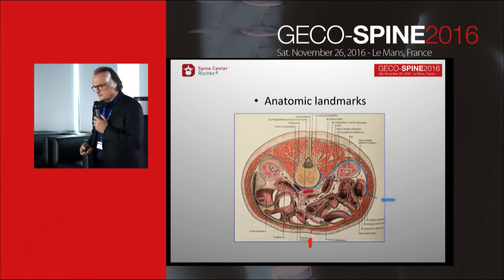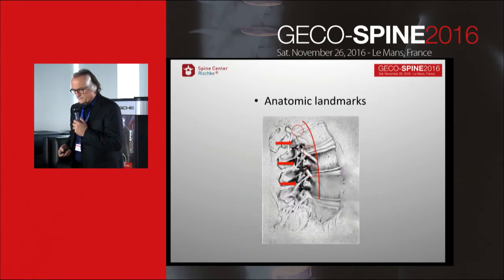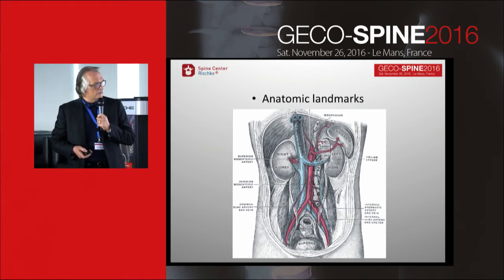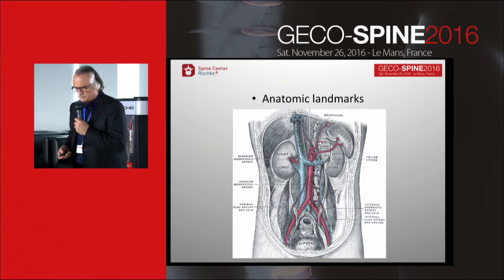It is possible in a slim patient, but in some cases, for instance a fat patient, I perform the lateral approach. And this is the problem we can see. We have the approach from anterolateral with the nerve branches lying near the foramen, so we only have access to the anterior lateral part of the disc. And as we can see here, for instance, the vertebra L1 is behind the left kidney, so it is a problem to remove the kidney from the retroperitoneum.